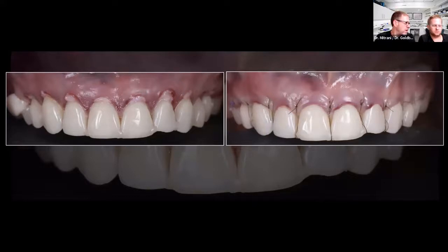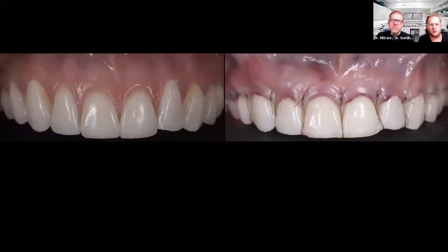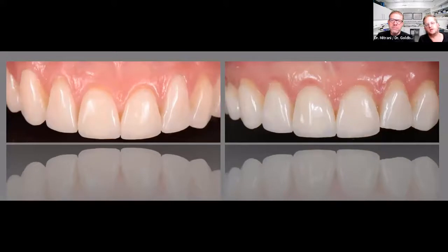Do you care to comment anything on the technique? Yeah, it's a technique that we use quite a bit. It's a tunneling technique, and we don't have a lot of time to go in depth. We sometimes use dermal matrix, we sometimes use connective tissue, or we combine both depending on the case. Here we decide to go with a dermal matrix, which works very well, and we're able to get a nice result by gaining or covering the recession, covering the roots, and also thickening the tissue as well.